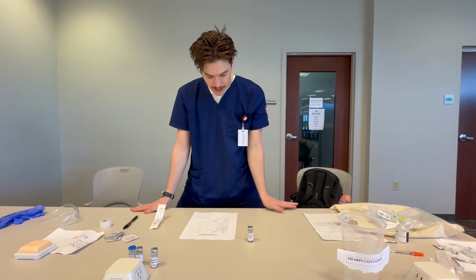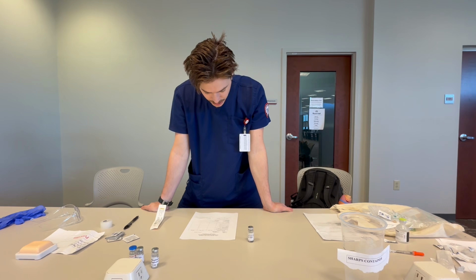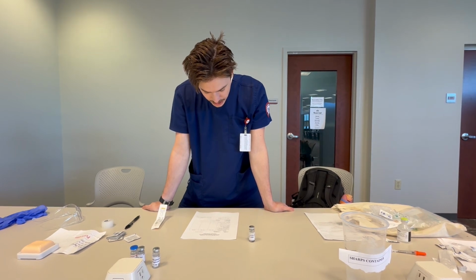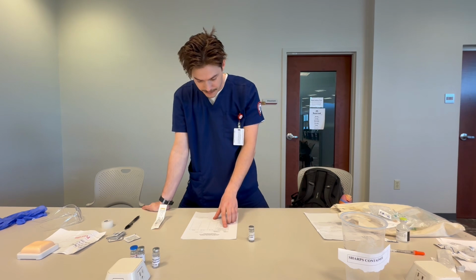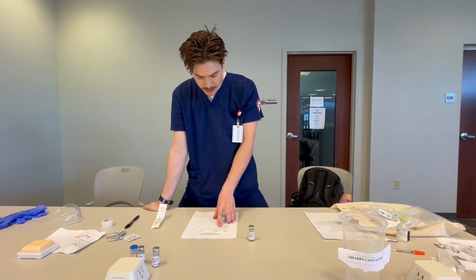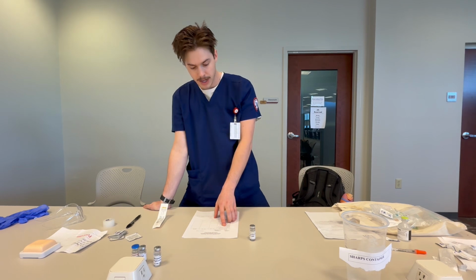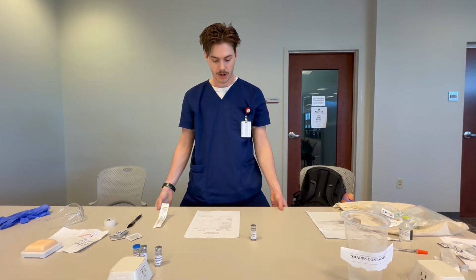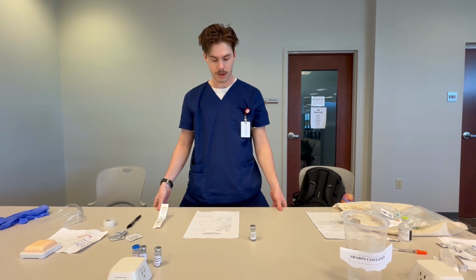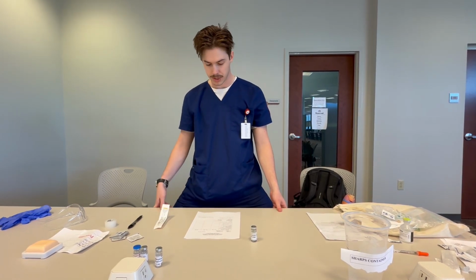He will be getting 10 units of insulin, that's the right dose. Subcutaneously is the right route, which is what I have here. 30 minutes is the right time, 30 minutes before his meal. He has a meal coming up in 30 minutes, so that is the right indication, which means all the elements of a legal prescription are present. And on that note, I will proceed.